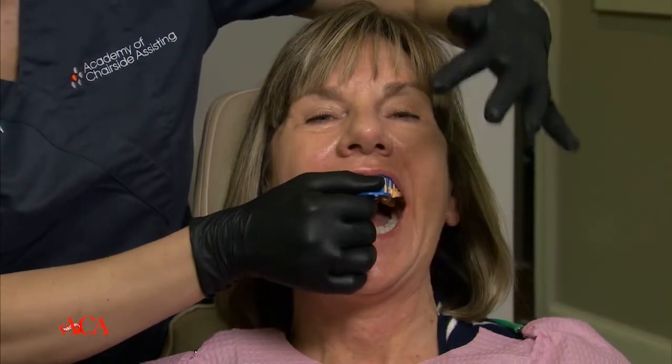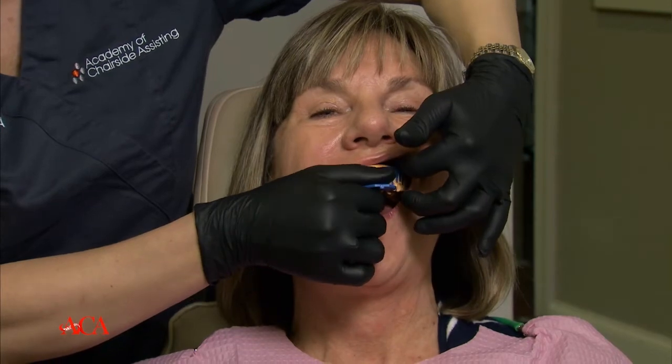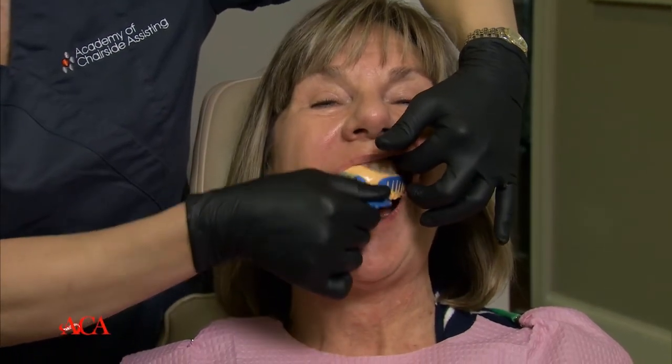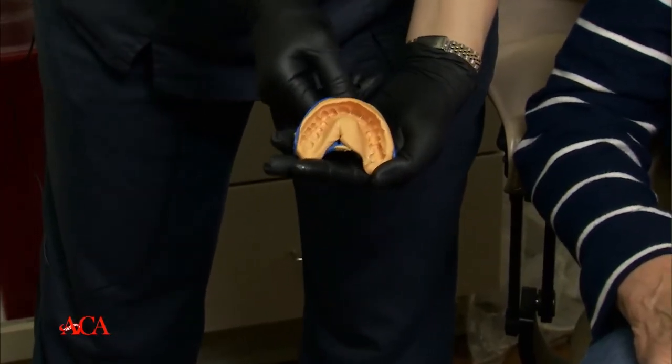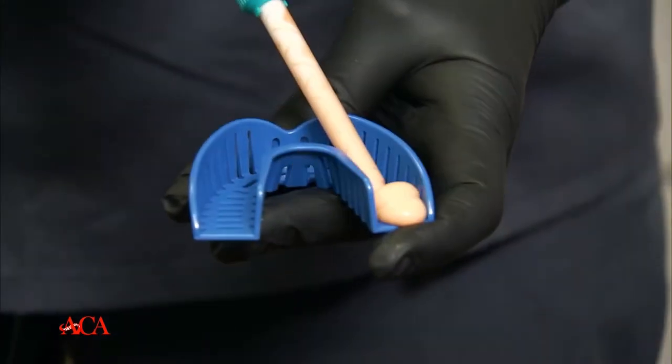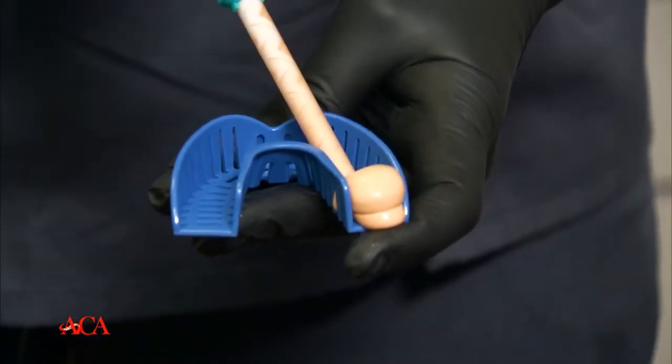So I'm going to take my finger and lift up her lip just a little bit and get a nice little rock out of it. And I'm going to pull this. And what I want to show you is my impression. So now we're going to go ahead and take an impression on the lower.